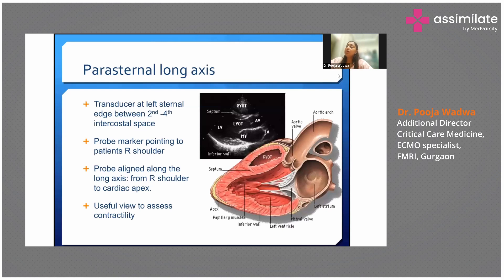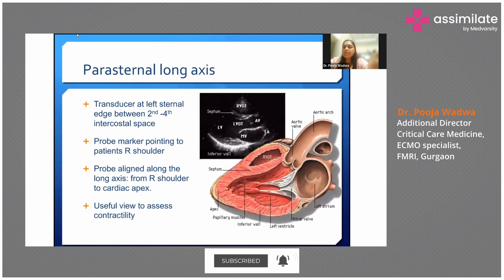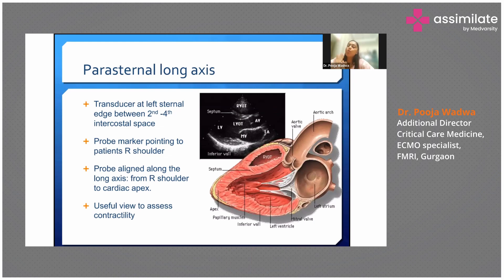This is a parasternal long axis view. The transducer of the probe is at the left sternal edge between the second and the fourth intercostal space, and the probe marker should always point towards the patient's right shoulder so that it is aligned along the long axis. This view tells us a lot about the contractility — you can see the contractility of all the chambers in this view.